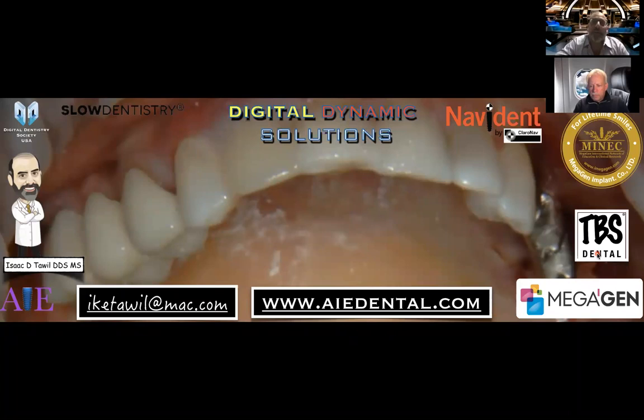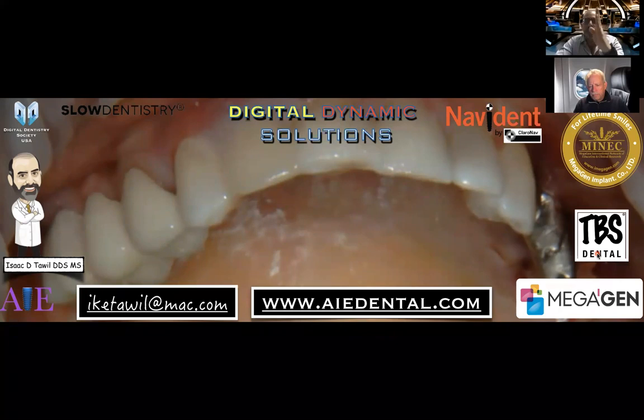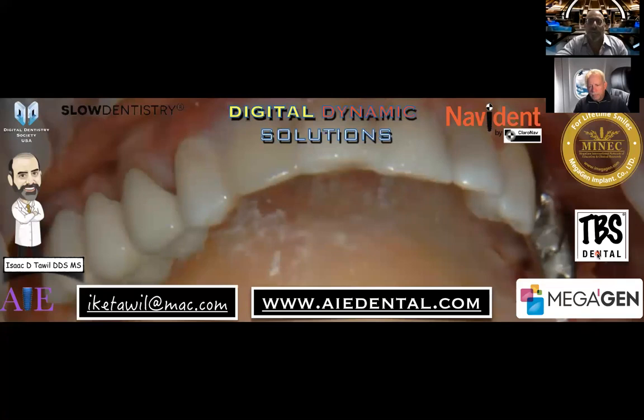As a matter of fact, it may be a tremendous benefit. If it's let's say a lateral incisor that's curving towards the canine, I now will be able to cut out that root towards the curve, where that apex is of the curve. And now I have a nice amount of non-disrupted bone where I can place my implant in a perfectly straightened out parallel position. So when I see those curved roots, I immediately think maybe immediately loading, because I'm going to have a lot of undisturbed bone that hasn't been drilled for an osteotomy. So removing the contents is quite easy with dynamic navigation or guided navigation. Without it, it is a little bit tricky.